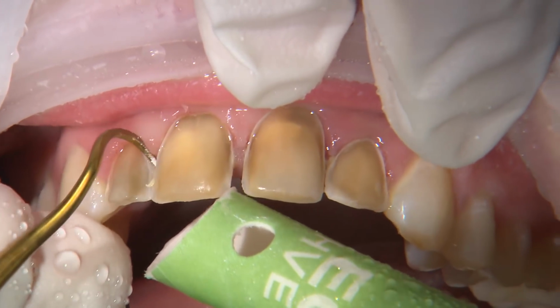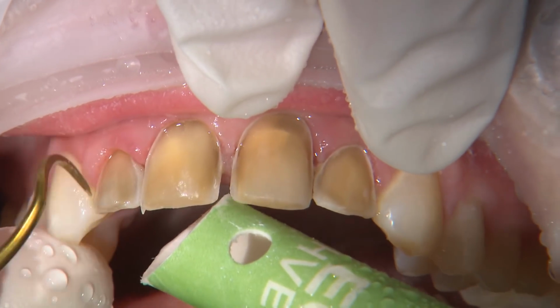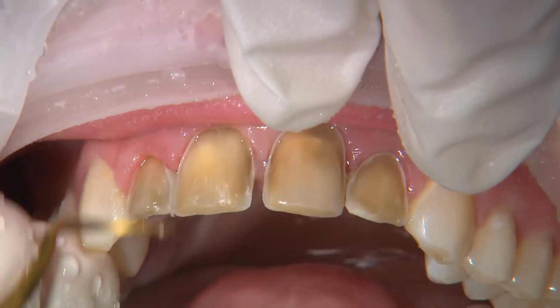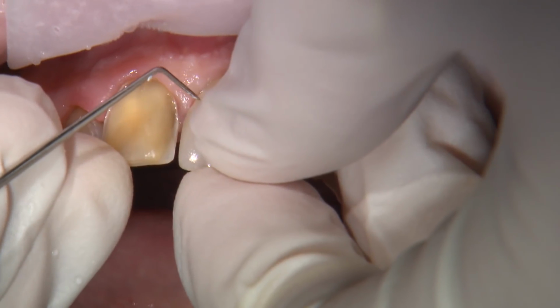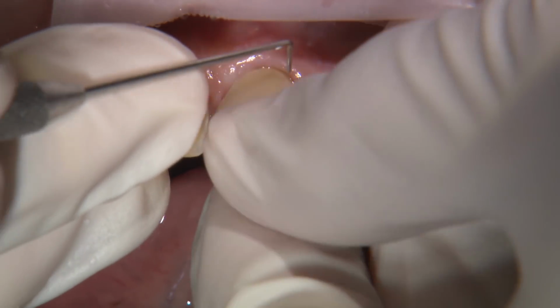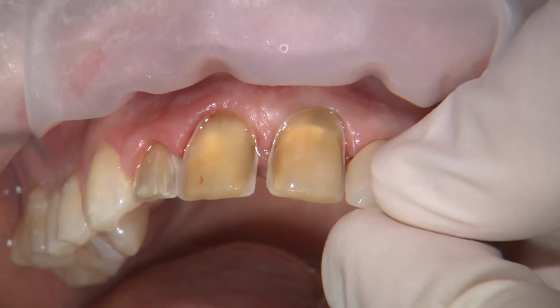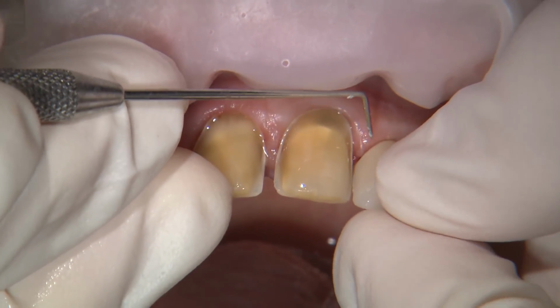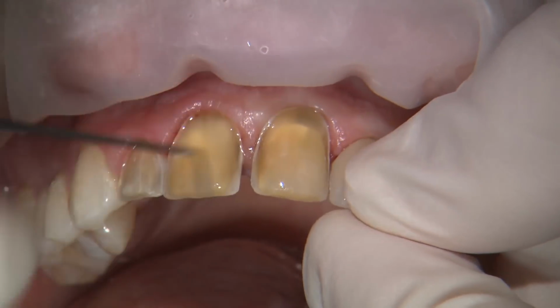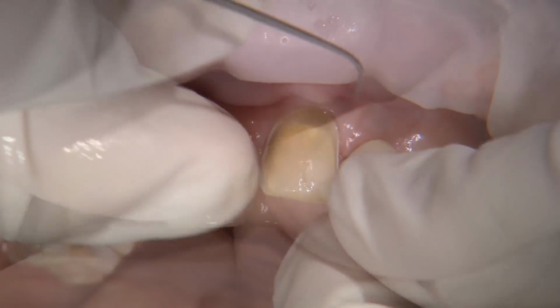If there are any areas of composite still on the tooth surface, I recommend using a slow speed round burr to gently remove the excess. I try in each veneer individually to verify they seat properly and the margins are flush to the teeth. With number 7 and 10, I check the distal contacts first to ensure that the contacts are not interfering with the seating of these restorations.